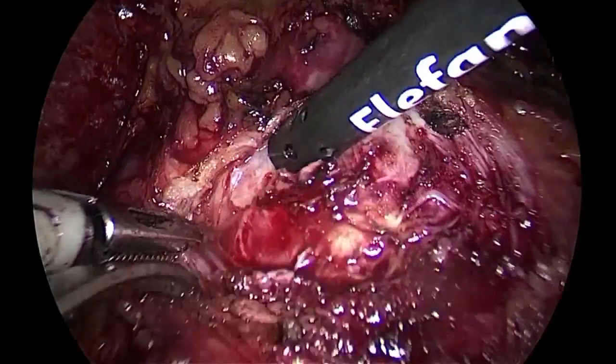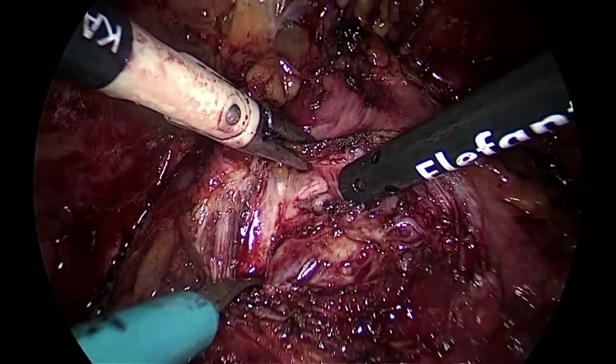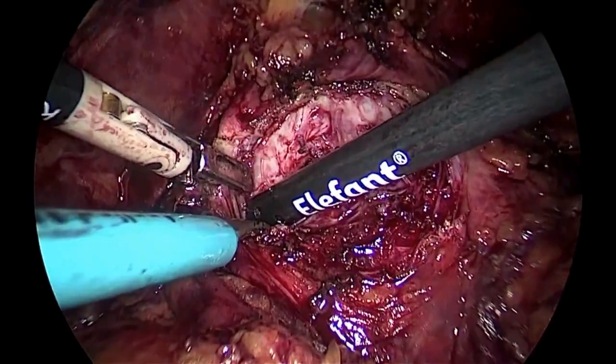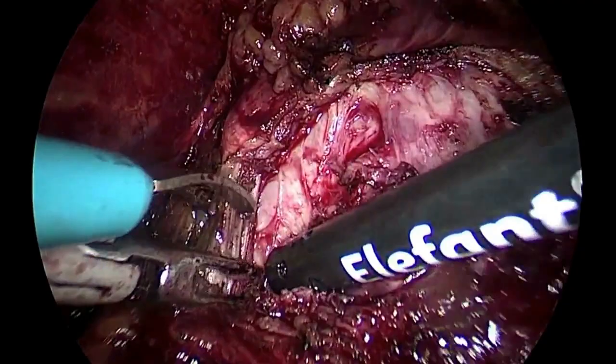Okay. As you can see, I can coagulate here now. Mono. Okay, good, very well.